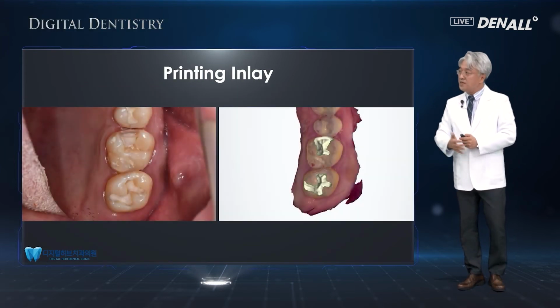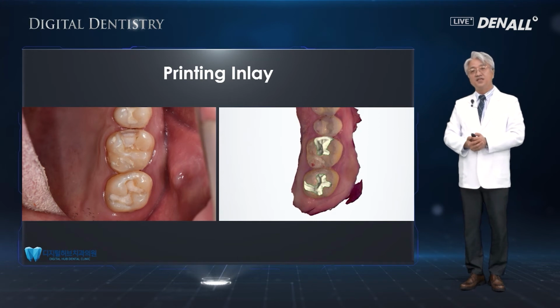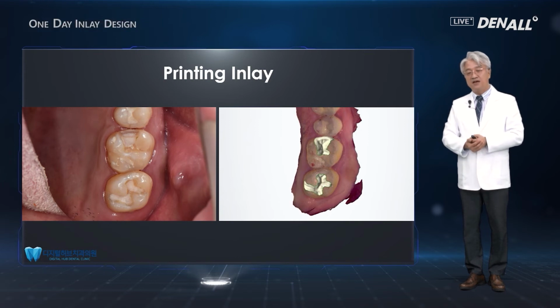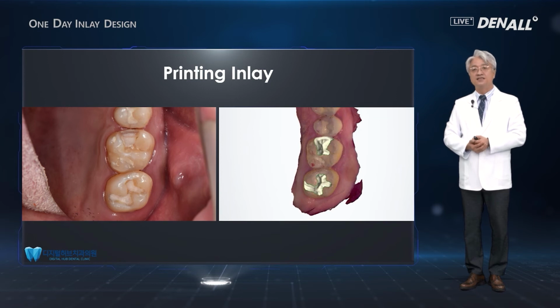Now, let's talk about printing inlay. The printing inlay, I think I'm using that a lot nowadays clinically, but the final materials are now available with resin and others.